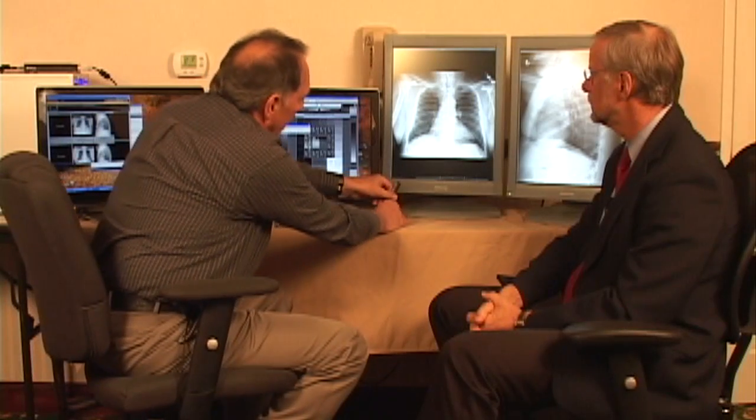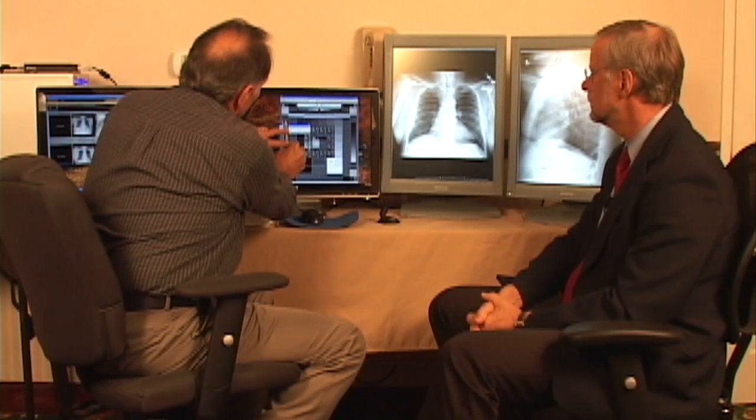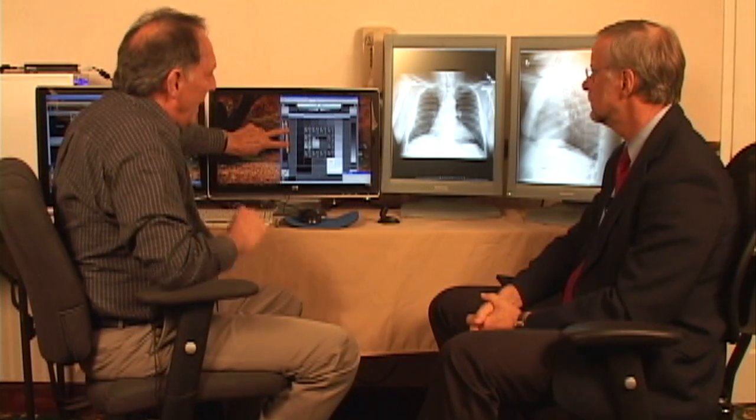Okay. So it's already preset to go as soon as I hit click. I need to have the light meter held to the center of the screen, and I'll just click OK here, and it'll prepare the test. It'll black the screen out. The actual software will take complete control of the display. It'll start with the darkest level and incrementally test in large steps. So you're going to see large steps.